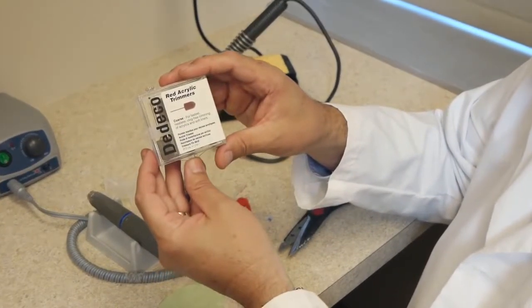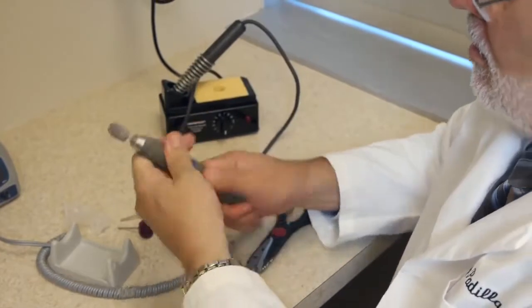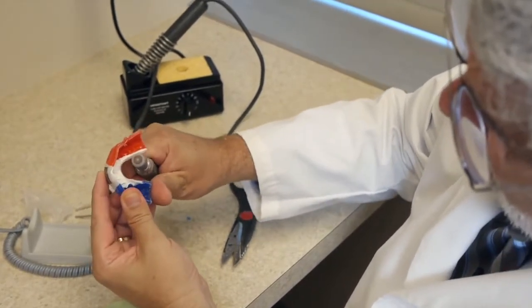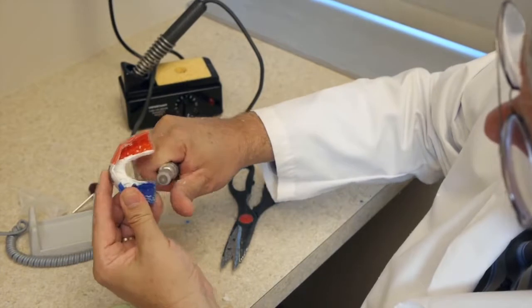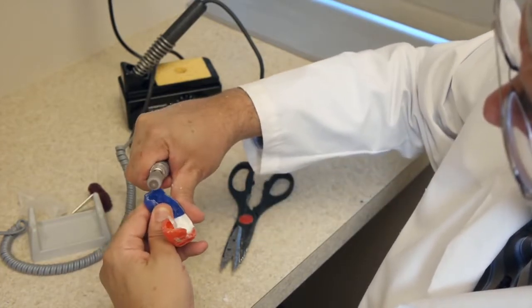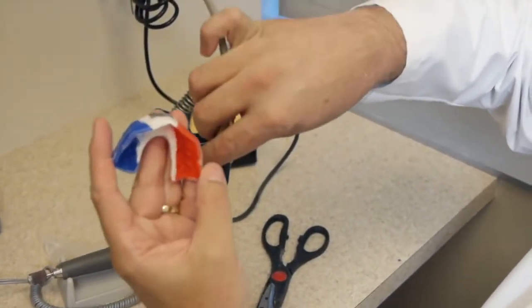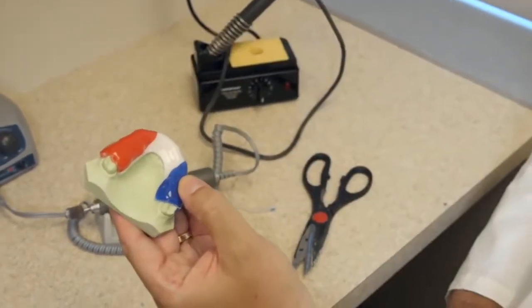I'm going to use my red acrylic stone trimmers. And again, we're going to trim right to the teeth. Now we're going to air blow the internal just to get all those little pieces out. And I'm going to place it back on the model. And now we're going to trim that lingual area I was talking about earlier.